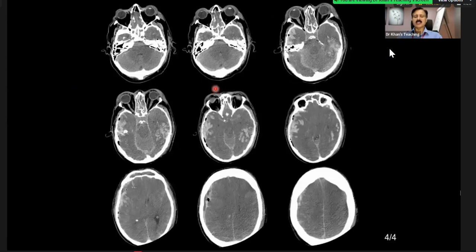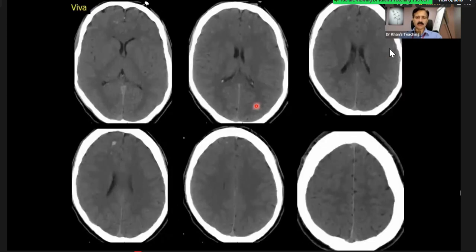And so the white cerebellum sign has also been asked. And in a brain dead type of case, we have already covered it, the pseudo subarachnoid sign that has also come in the exam.